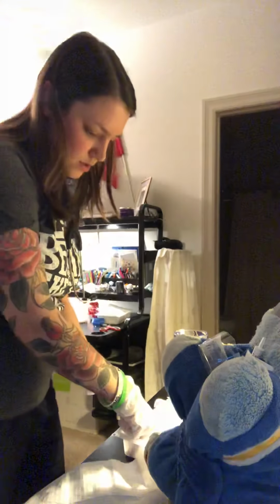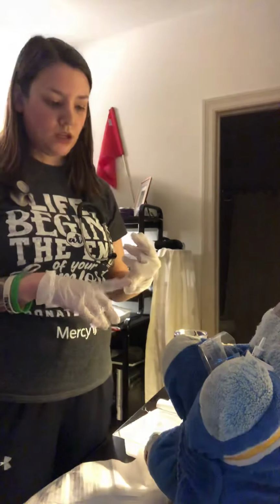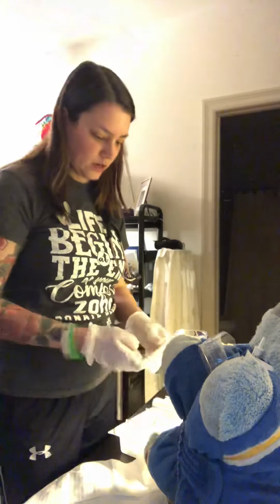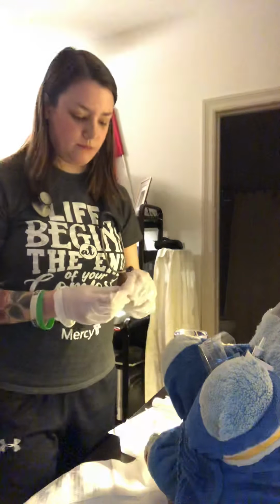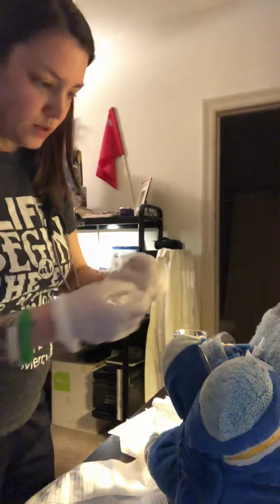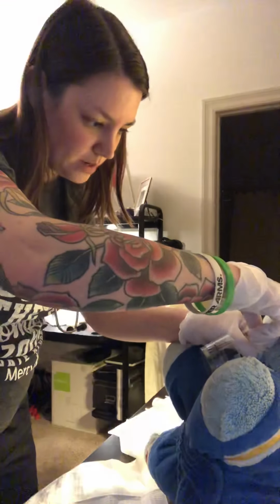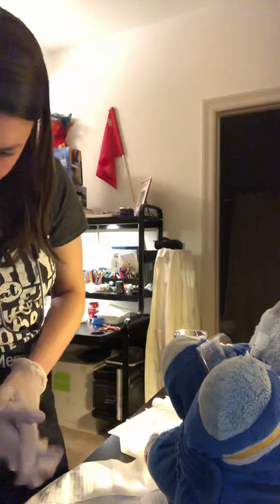Then I would insert a new one. The video shows that there's two different kinds, a disposable or a reusable one. So if I was using a reusable one, I would obviously clean it really well, get inside this guy here and clean it with some saline, dry it out, and then I would insert it after it was all dry. Okay, so I'll put a new one on there. Turn it till it clicks. You can feel it or you'll be able to hear it, but with this one obviously you won't be able to.